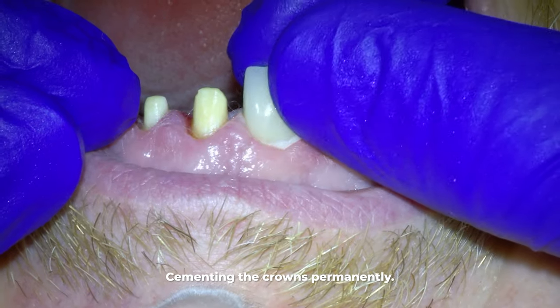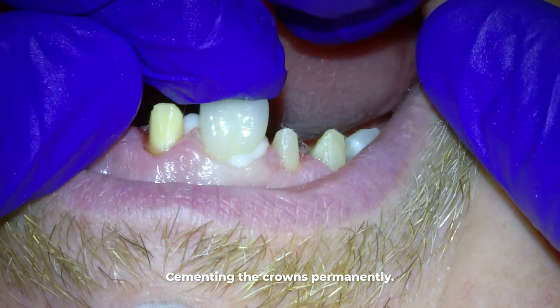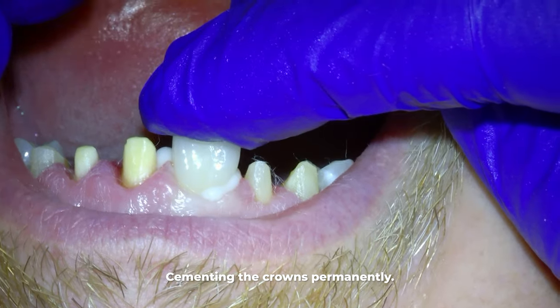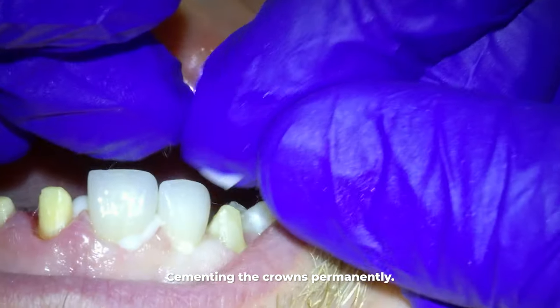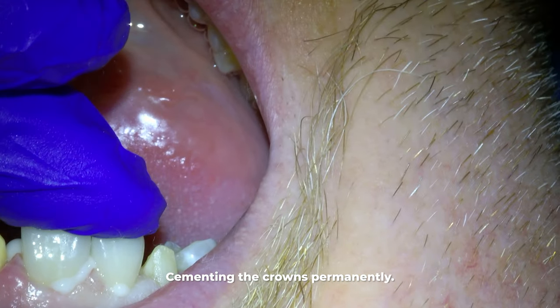Cosmetics are different for each person. With our patient here today, he was particular about the shape of his teeth — he wanted to ensure that the distal edges were sufficiently rounded and the crowns slightly wider than his remaining teeth.